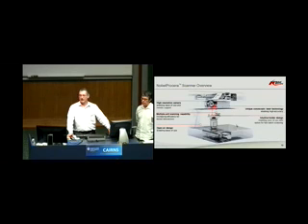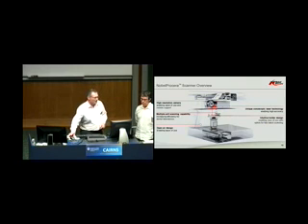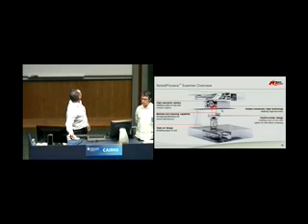So what is the scanner, for those that want to know? It's a conoscopic holographic laser scanner, or a non-contact laser scanner. Can you see my mouse? Oh yeah, that's good.